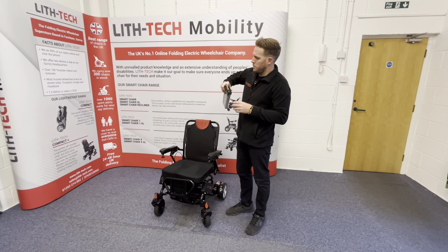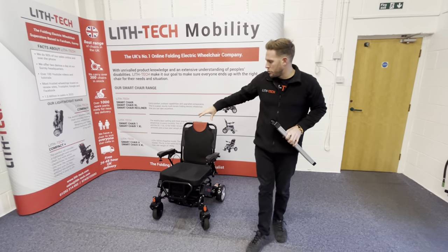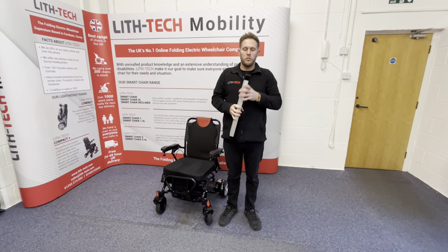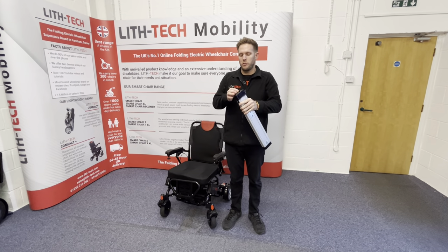By pressing this little blue button, you can see how much battery charge each battery has. These chairs can be charged through the joystick, which charges both batteries on the chair at the same time. Or if you want to keep your chair in the car, you can just whip the batteries out and there's a charging port in the battery for off-board charging as well.